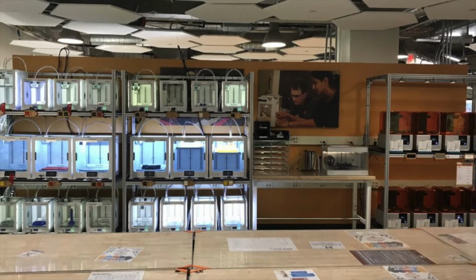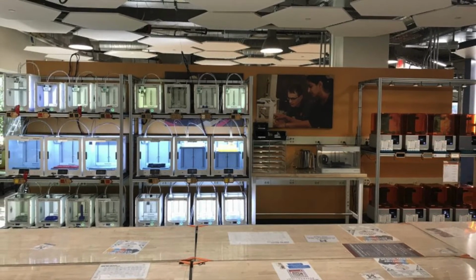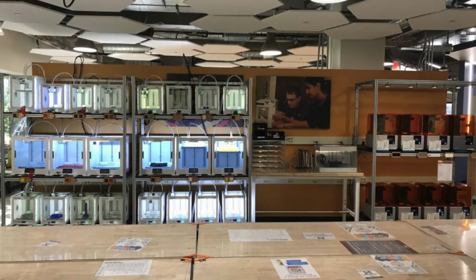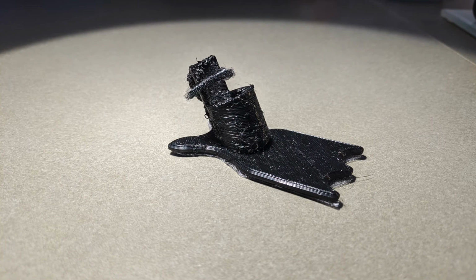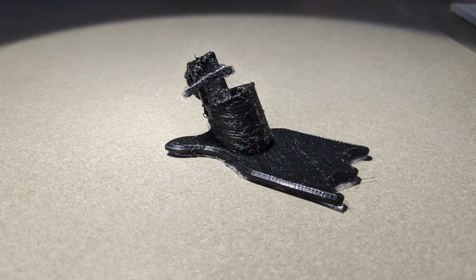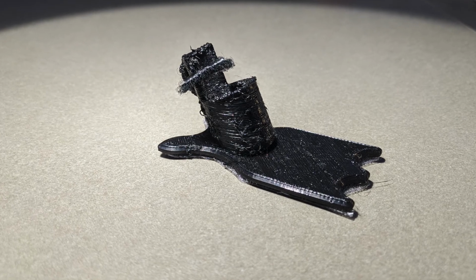After we determined that our materials were correct and our sizing was now correct, we could go on to the fabrication of our final product. After our final product was 3D printed, we then added in the silicone into that basin as well as attached the Velcro to the top.